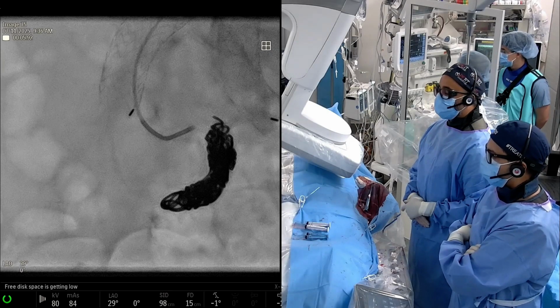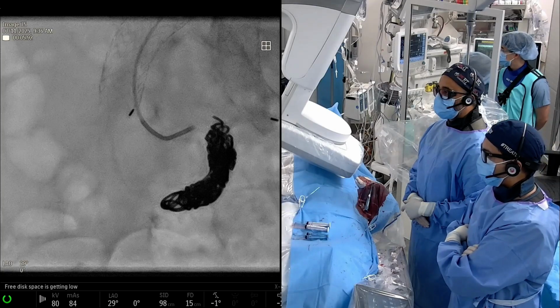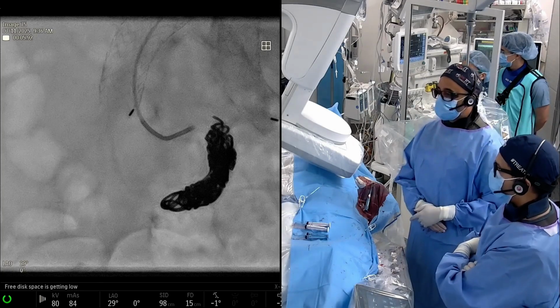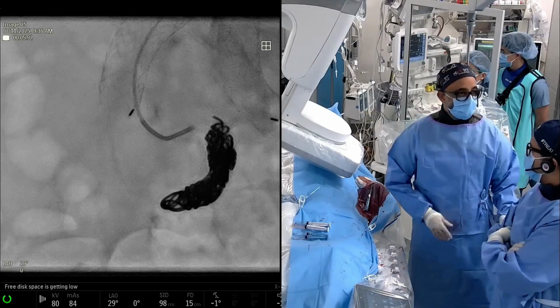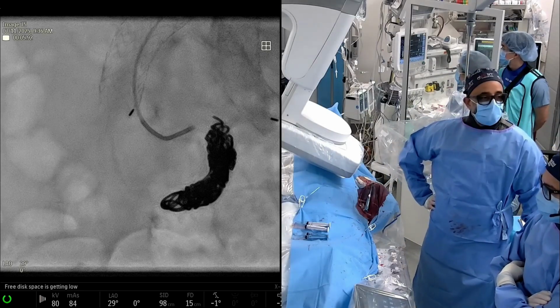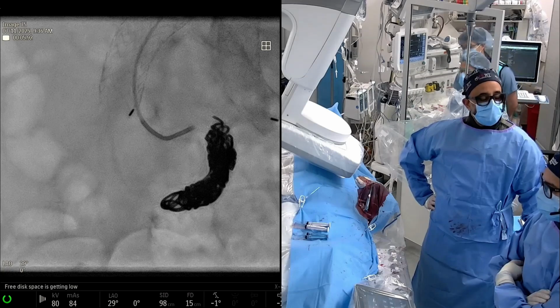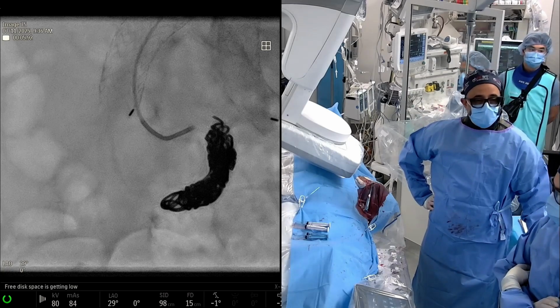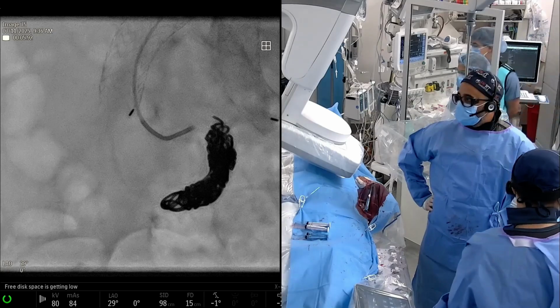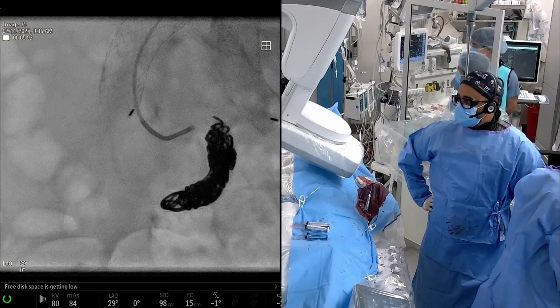Yeah, exactly. I think you get into the interstices and then fill in the spaces between those, because it's still going to have space between those 030 diameter things, and you fill it with some more softer stuff. It doesn't even have to be long. Can I get a 2.8 Progreat 150 and we get like a 60 regular packing? Yeah, I don't even know if you need that. You just need to fill the dead space.